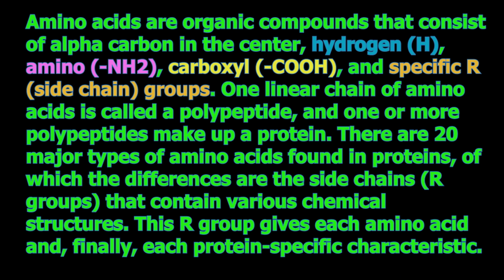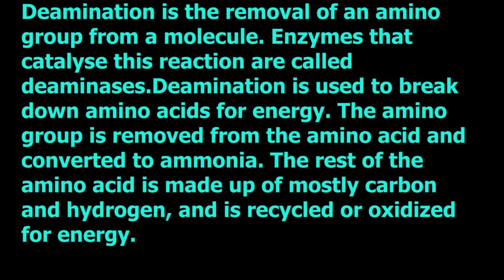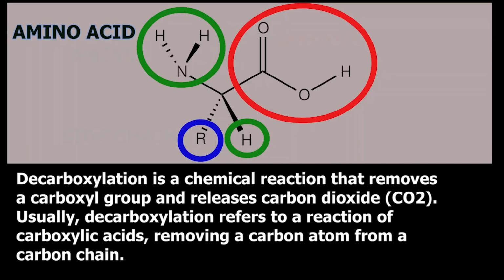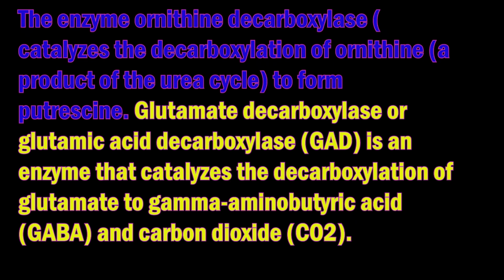Amino acid degradation. Identification of the ability of bacteria to produce enzymes that either deaminate, dihydrolase, or decarboxylate certain amino acids is often used in identification schemes. The amino acid substrates most often tested are lysine, ornithine, arginine, and phenylalanine.